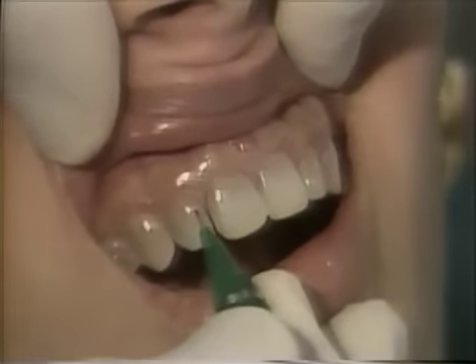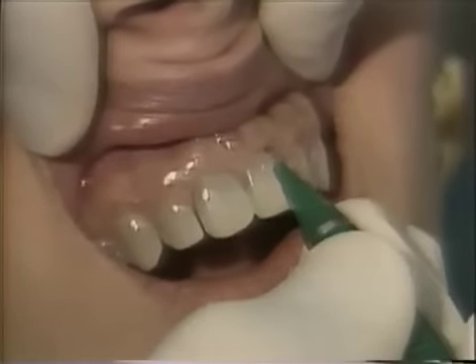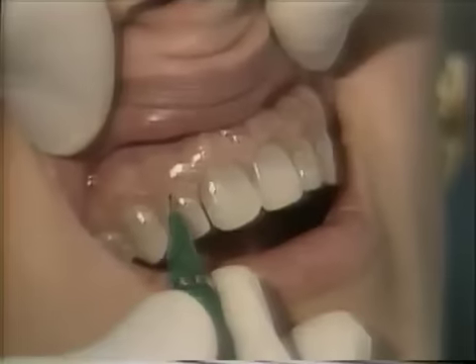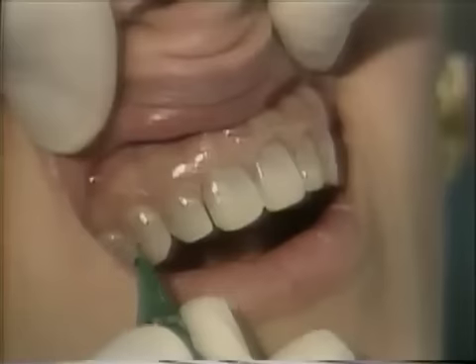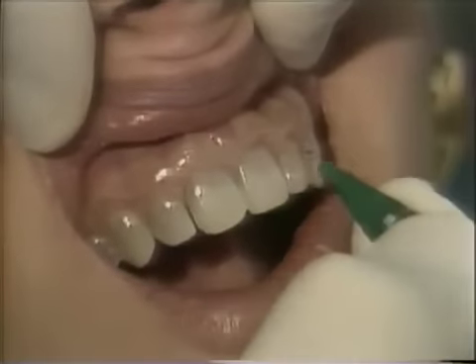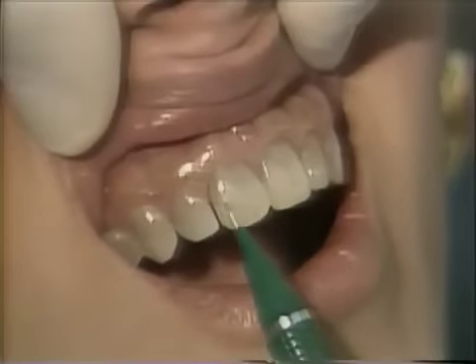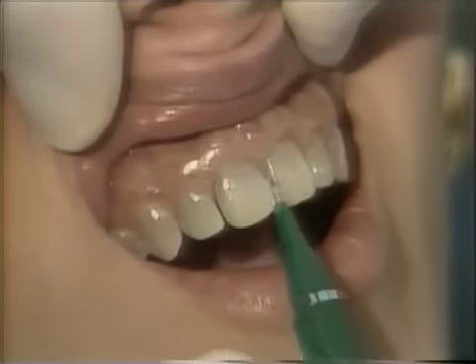If this were not tetracycline staining, we would leave the margin about a half a millimeter above the soft tissue. But in this instance, we need to bring it under the soft tissue so that we can mask out that purple color. On all of these, we'll be preparing a vertical depth cut of about five-tenths of a millimeter, and then reduce the labial surface into the interproximal, preparing a chamfer along the periphery of the entire tooth.